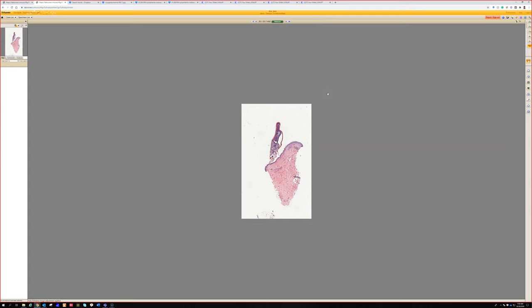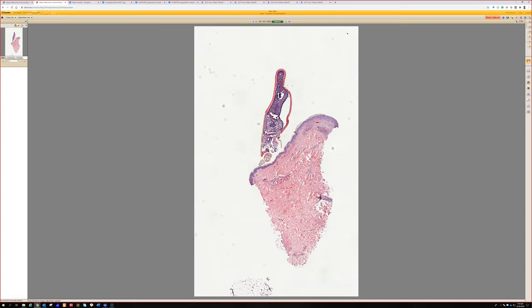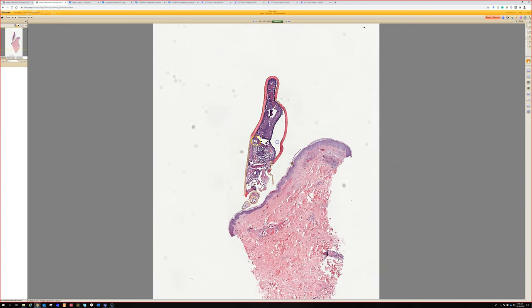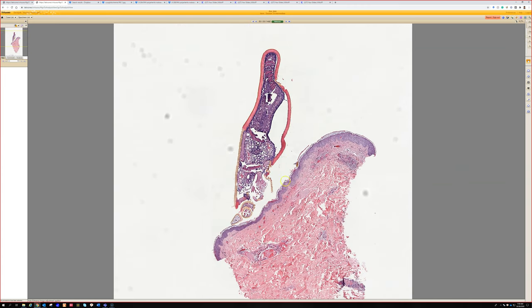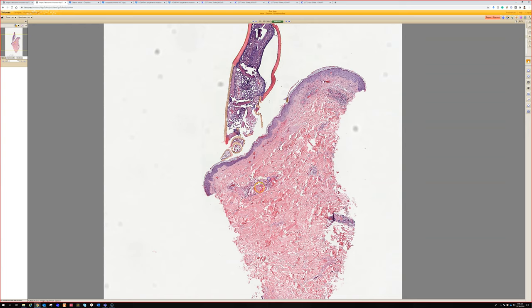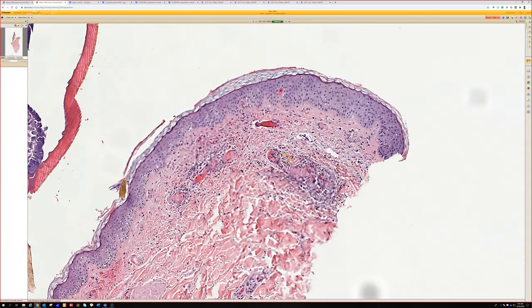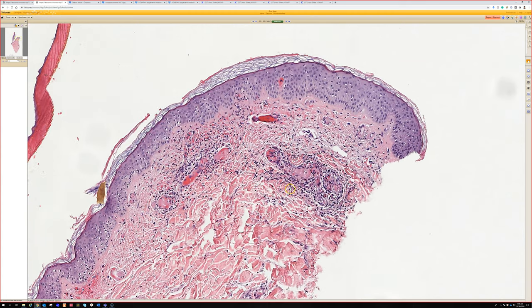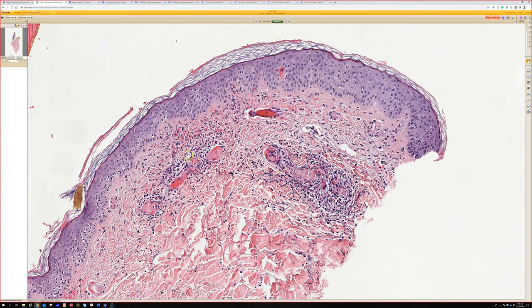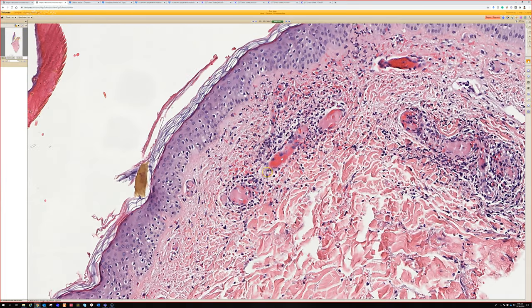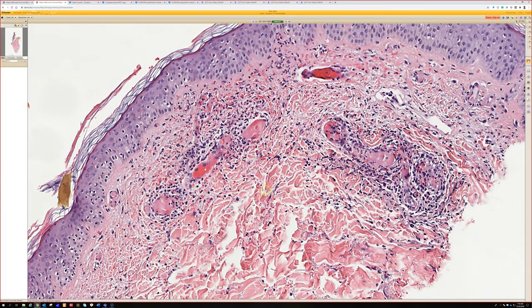Case seven. This one had a big bite that was really positive. And underneath that was leukocytoclastic vasculitis just as a reactive phenomenon. So I saw nuclear debris, RBC extravasation, some fibrin in that position, and then an expanded vessel wall. Really nice LCV.